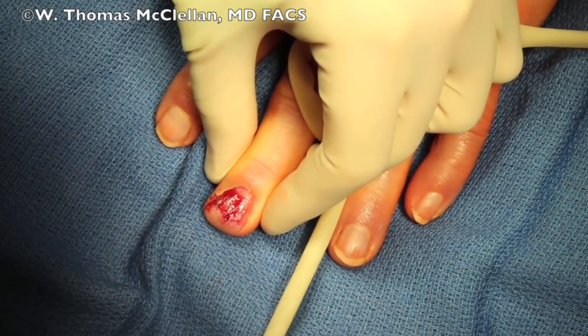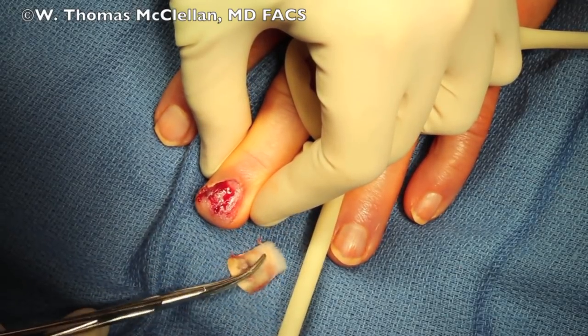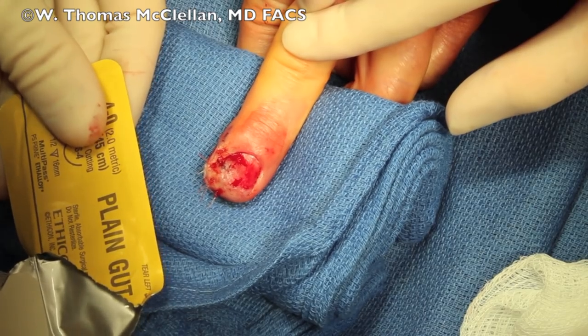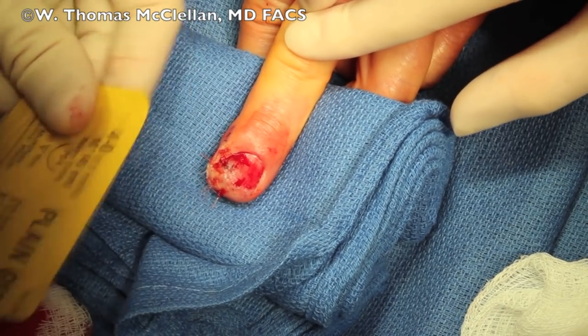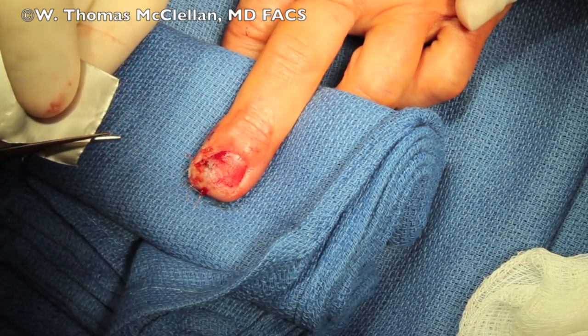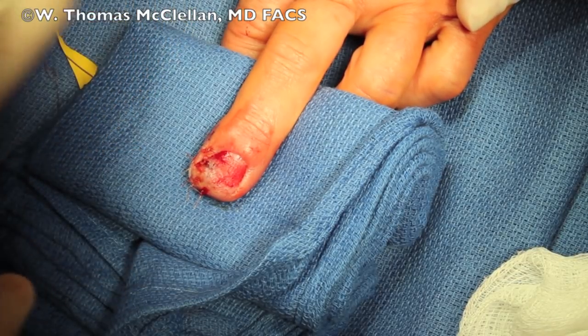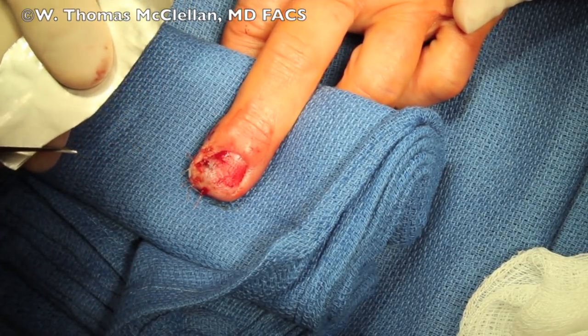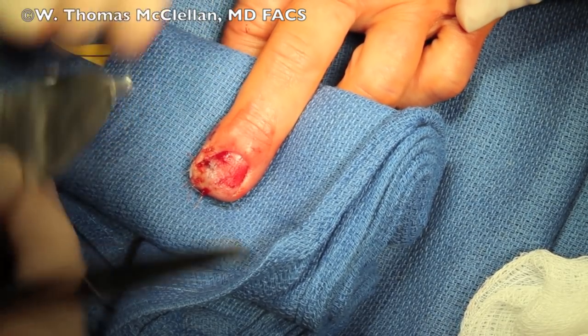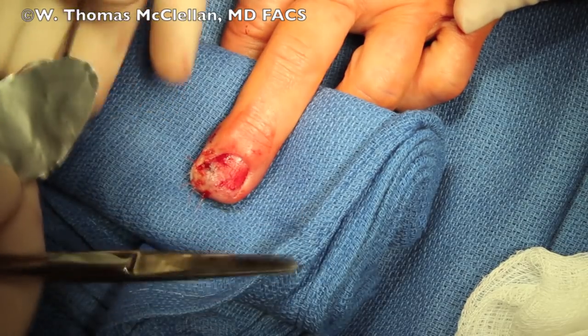And that's just the adhesions over at the germinal matrix to the skin. Now, if you don't have the nail, you can use a plain gut suture foil, or suture packet, and you can trim the suture packet into a new nail. This is really useful in a traumatic loss of parts of the fingertip or a traumatic loss of the nail where you don't have a nail.